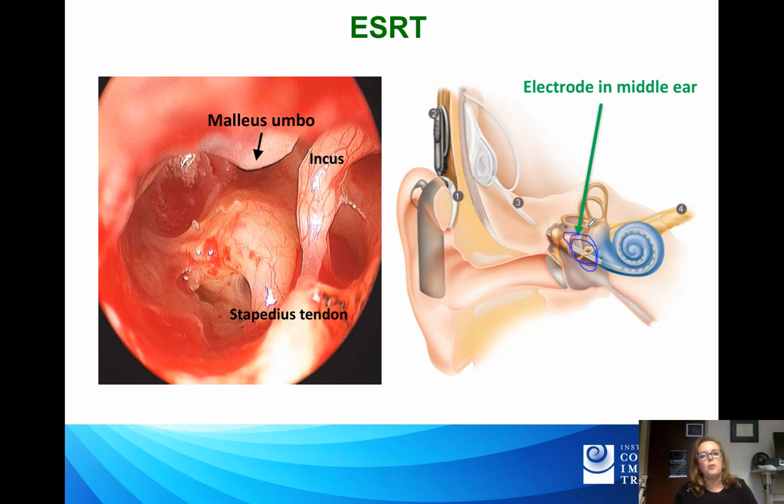But it's important for us to remember we have more people with bilateral implants, which means more people for whom we're not going to be able to place a probe in a non-implanted ear. And so thankfully we've got a lot of options at our disposal with our admittance systems, so we can try different probe tone frequencies to get around the fact that the middle ear system is essentially altered mechanically in some way and can affect the response that we measure.